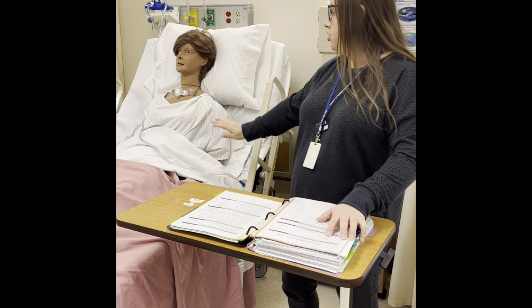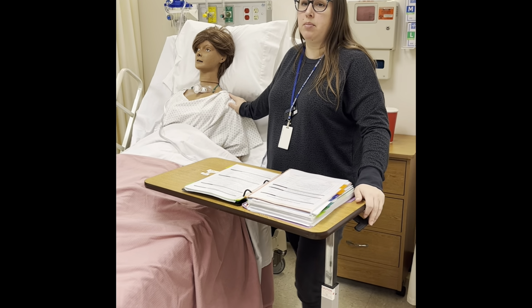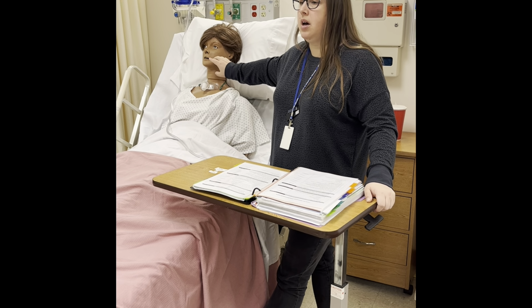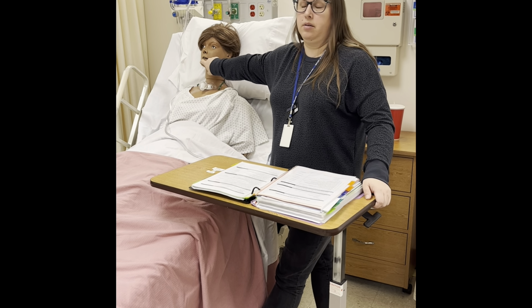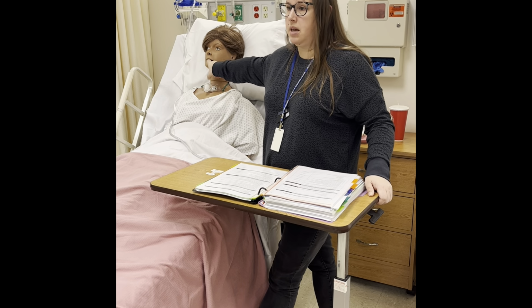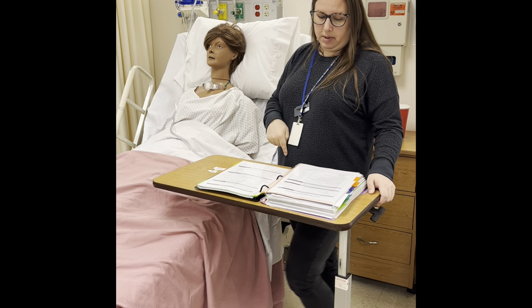Aspiration. Is our patient at risk for aspiration? Will they aspirate if they get this tube? If they're at high aspiration risk, most likely they can't protect their airway. So we're gonna have to put a breathing tube in, and then we would put an oral gastric tube. We would take the same tube and just slide it in the mouth right down into the stomach.